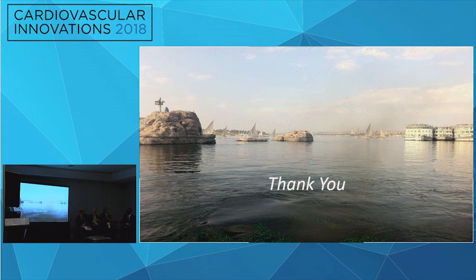And I like the fact that you rolled your camera around, not only to facilitate good visualization of the target lesion, but remembering also that it helps minimize risk of radiation injury to one particular part of the skin. And one thing I do think we don't do enough of in these complex cases, CTOs and otherwise, is shutter in the image. Once you've seen the field of play in your diagnostic studies and you have a good idea of what you're after, remember to collimate down and minimize the exposure of X-ray, particularly when you see a long case coming like this.